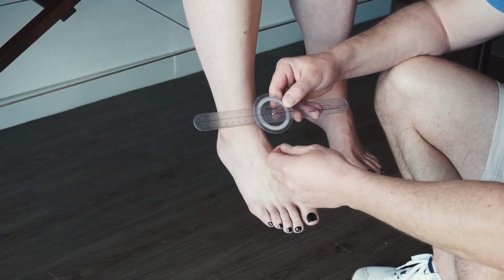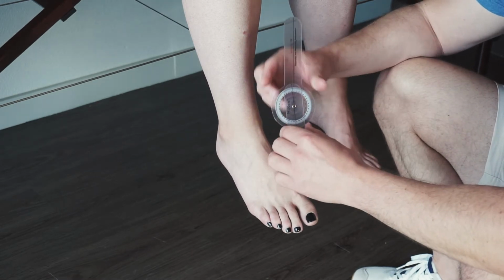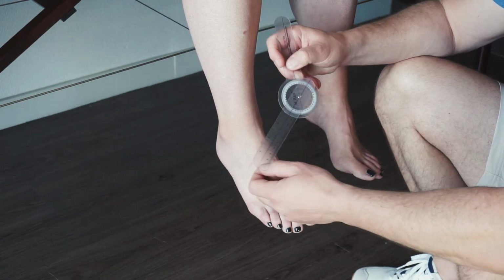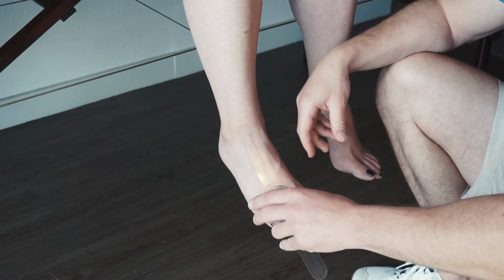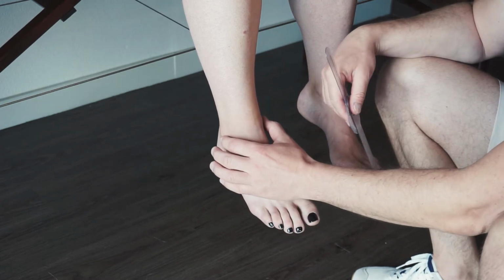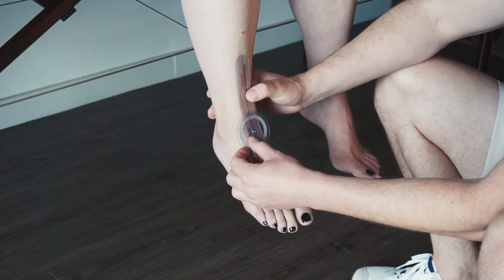The proximal arm is the one that's actually connected to the degrees, so it's the bigger one. And then the distal arm, or the moving arm, is the one that if you move it, the measurements don't move, it stays stationary there. So we need to find the axis. The axis is going to be bisecting the malleoli. You're going to put that axis right there.